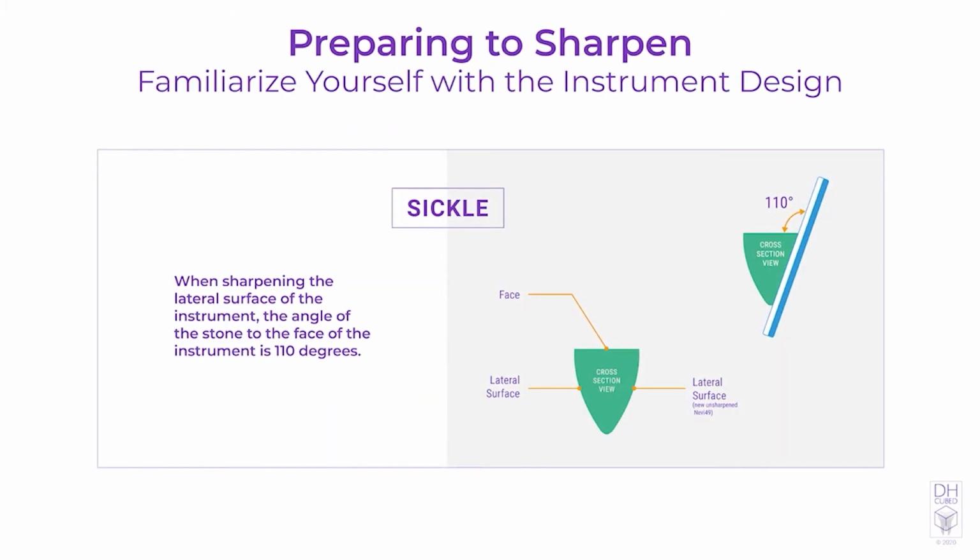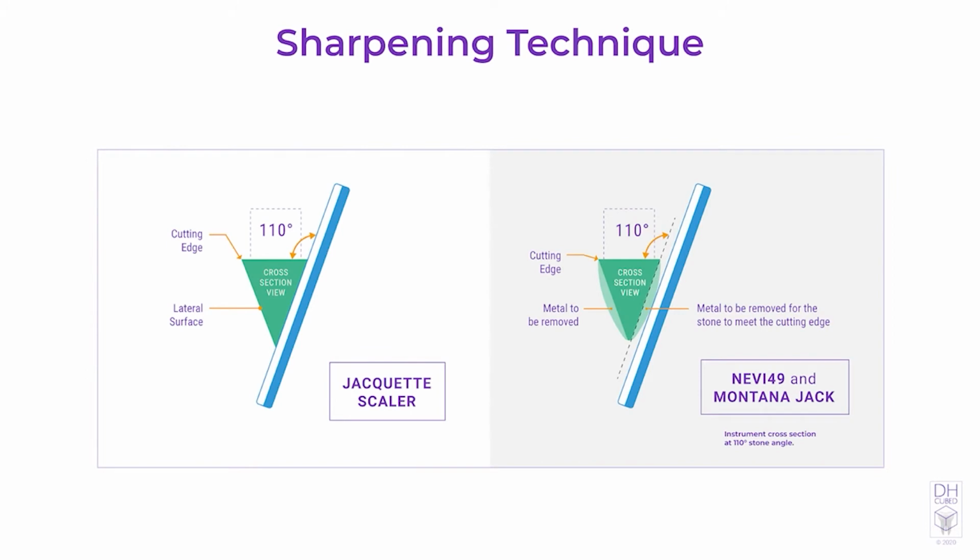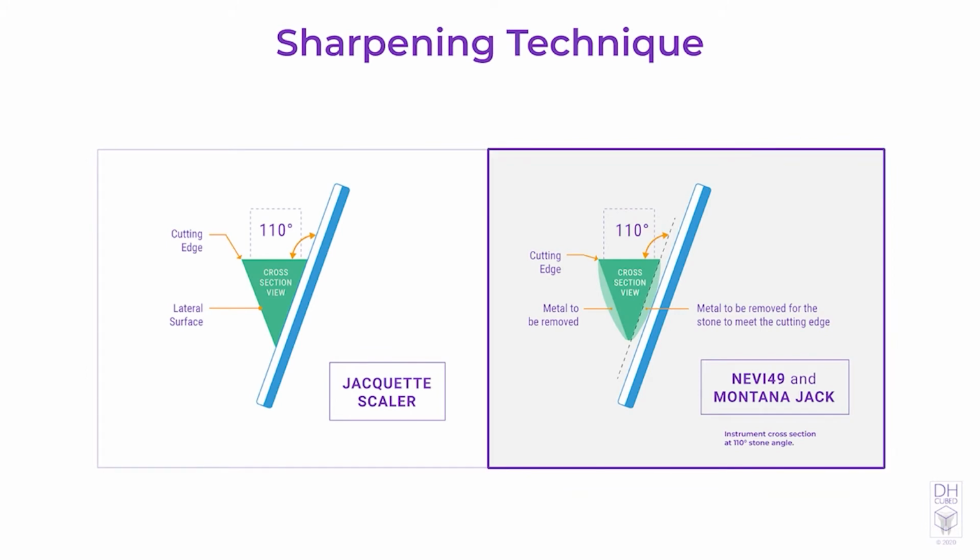When sharpening the lateral surface of the instrument, the angle of the stone to the face of the instrument is 110 degrees. When it is time to sharpen your sickle scaler like the Nevi 49 or the Montana Jack for the first time, you will need to remove the curved shape on the lateral sides before your stone can meet the cutting edge. Essentially, you will end up having to turn it into an absolute triangle in cross-section. It will take longer to remove the metal the first time in order to get a sharp cutting edge.